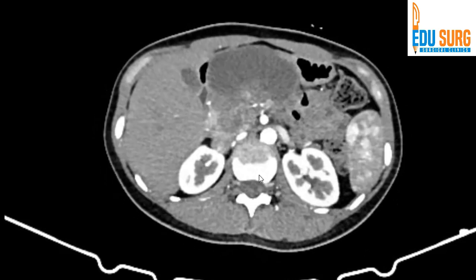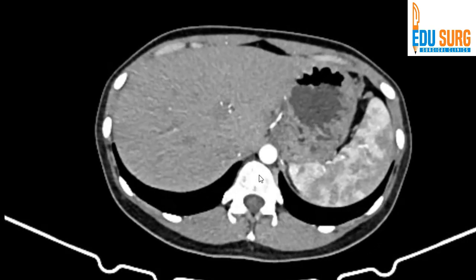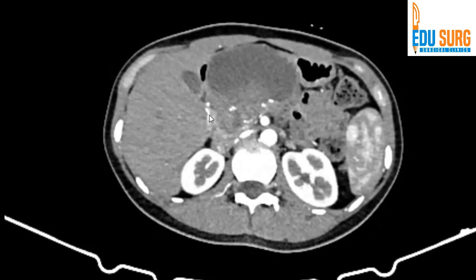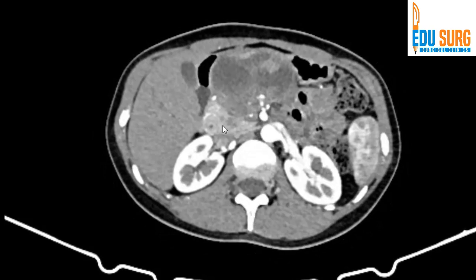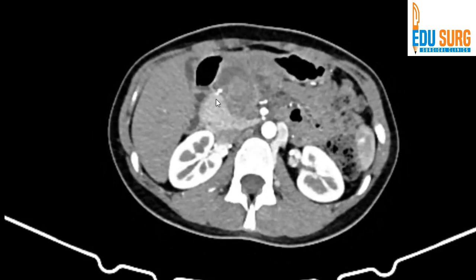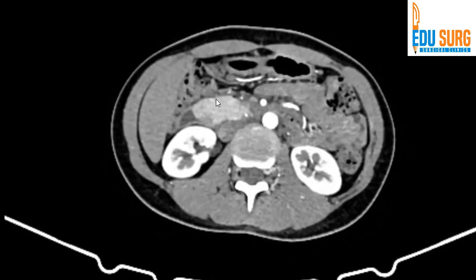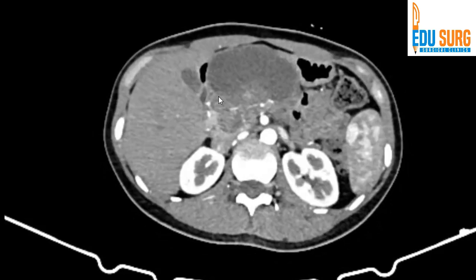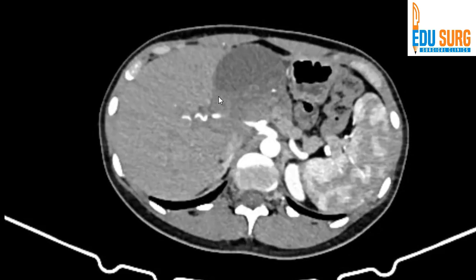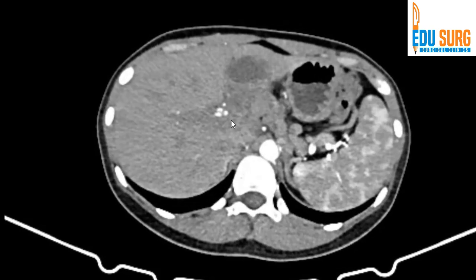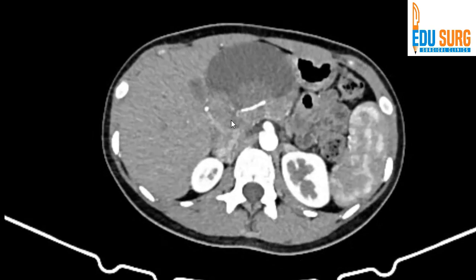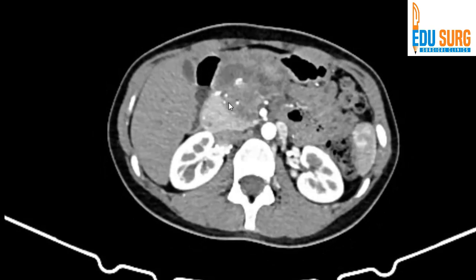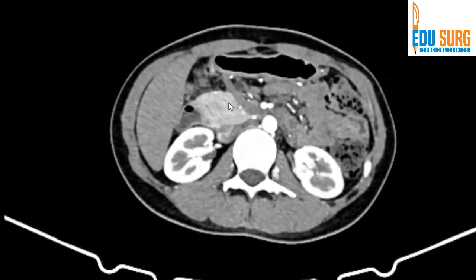Another important structure you have to see here is the gastroduodenal artery. This is the gastroduodenal artery, and you can see that it is skirting and entering the tumor. You can trace it nicely, coming into the common hepatic. The gastroduodenal artery is important when we plan surgery for this patient because it is skirting at one edge of the tumor, so the gastroduodenal artery is going to get resected.